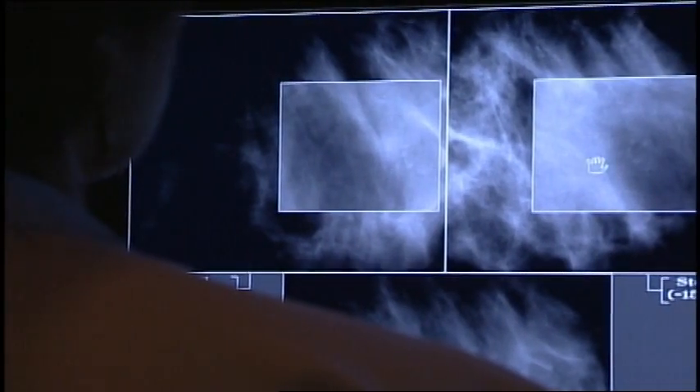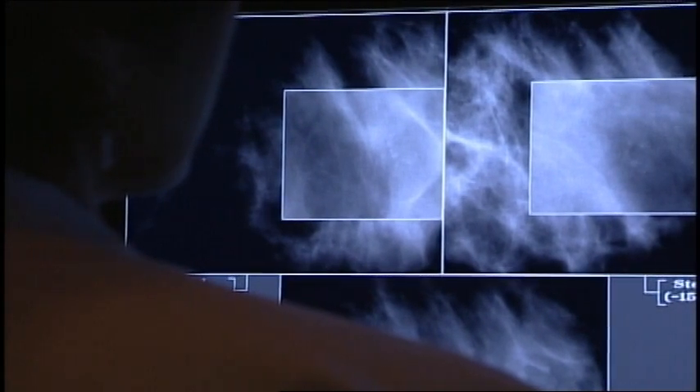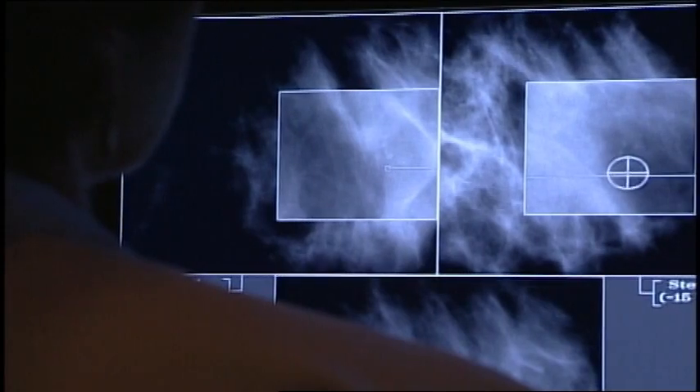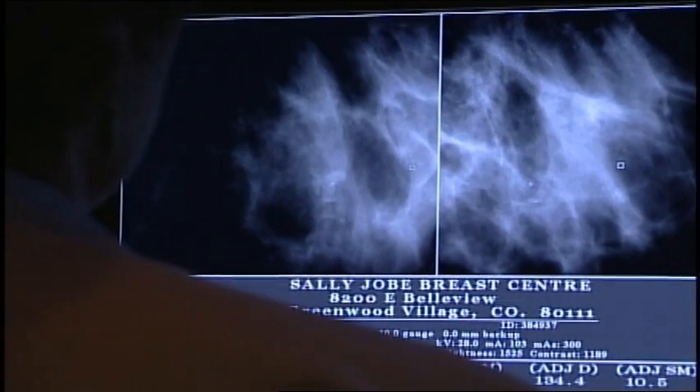This patient has some suspicious calcifications in her left breast. We've taken our scout and our two stereo pair images and we're just lining up our cursor on the calcifications, targeting the calcifications.